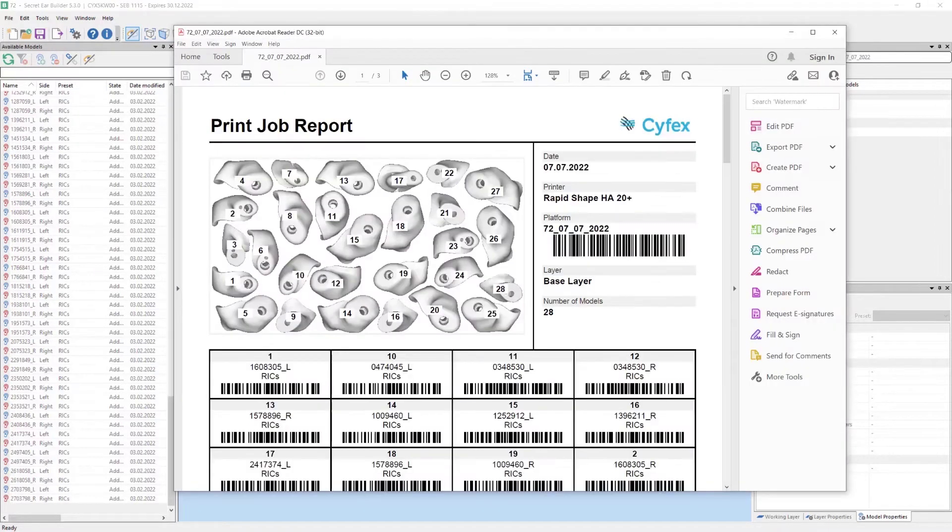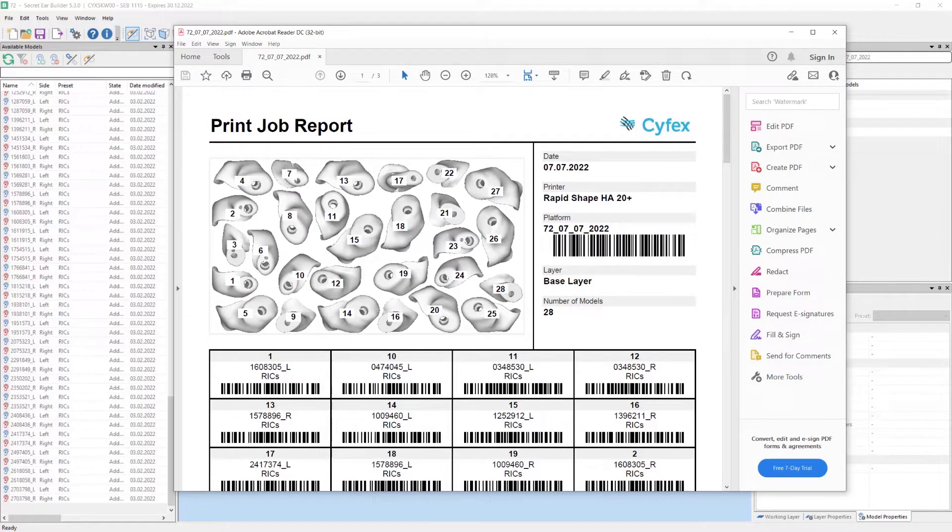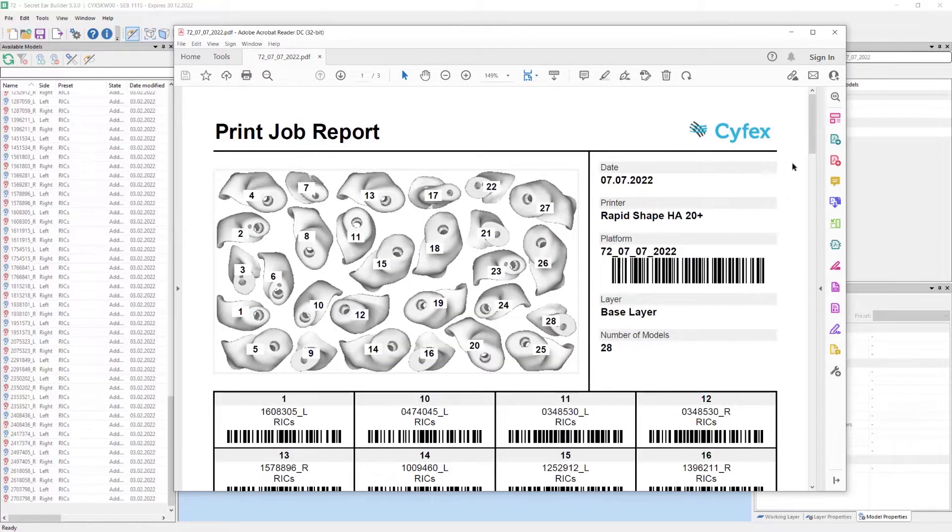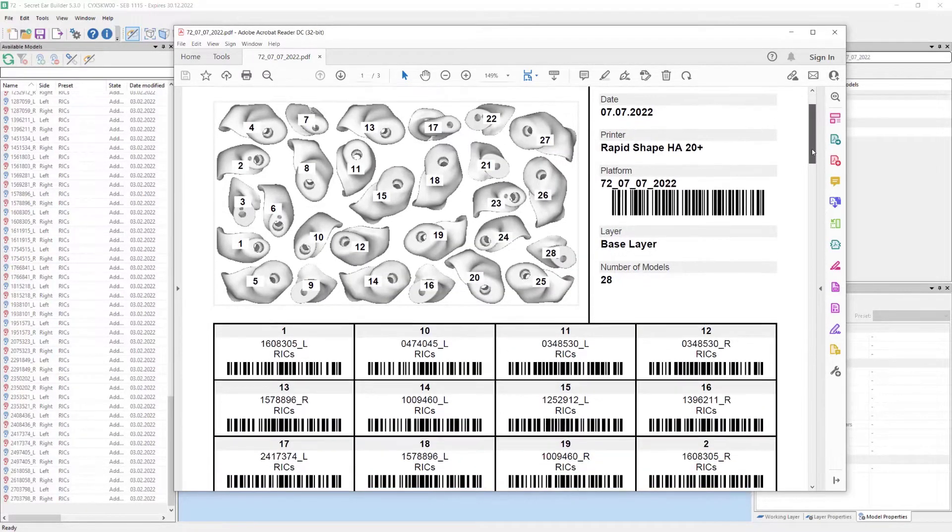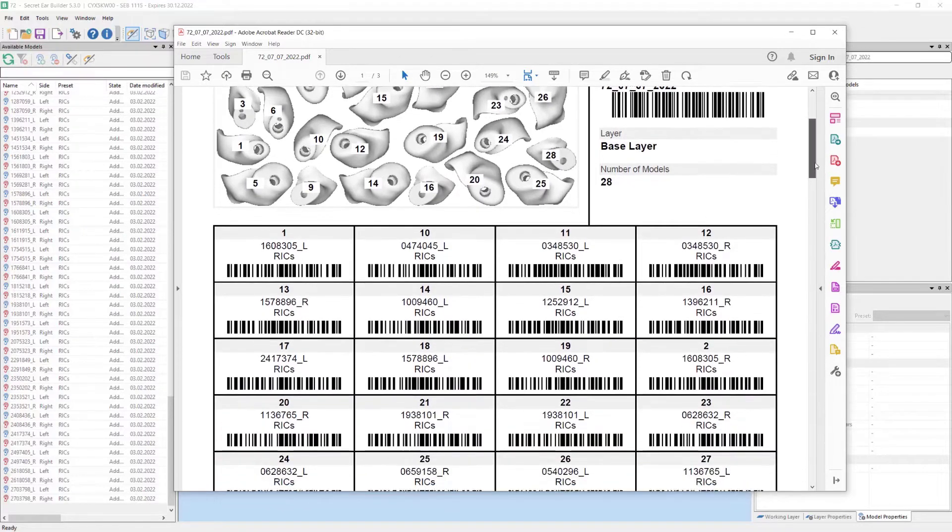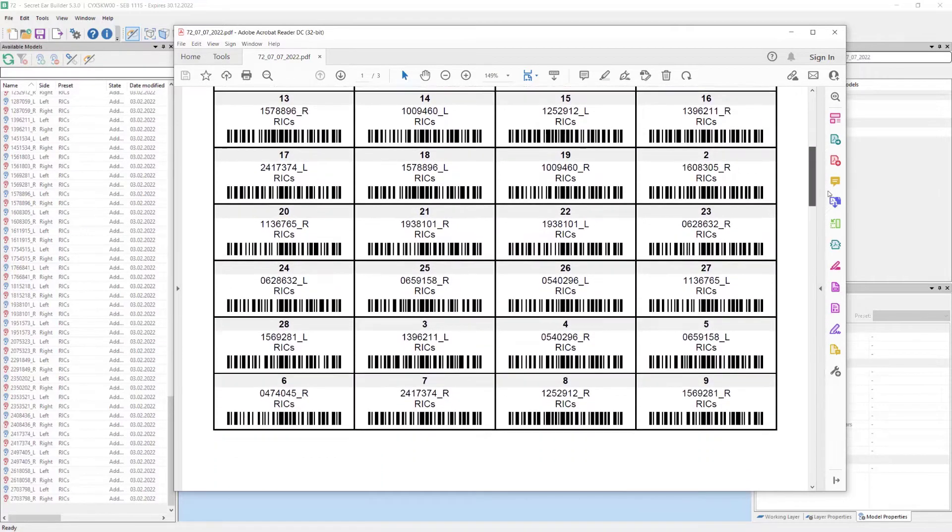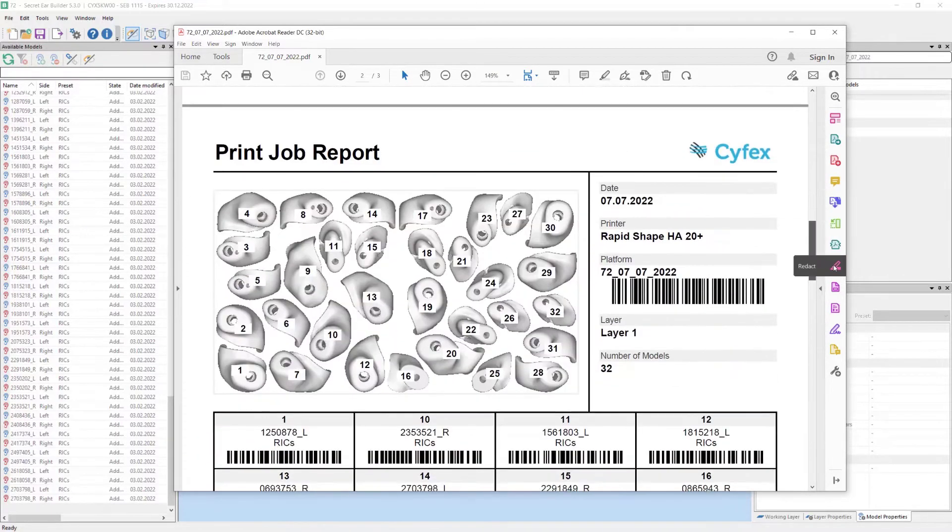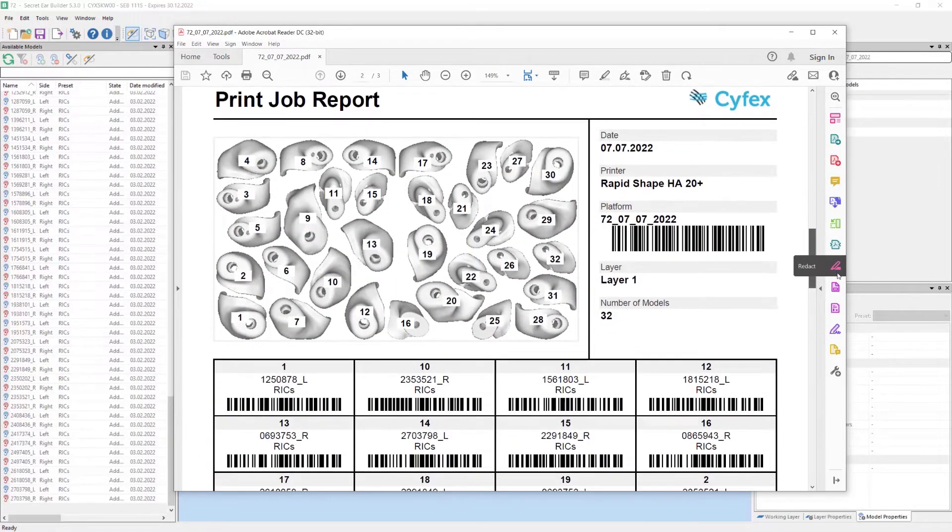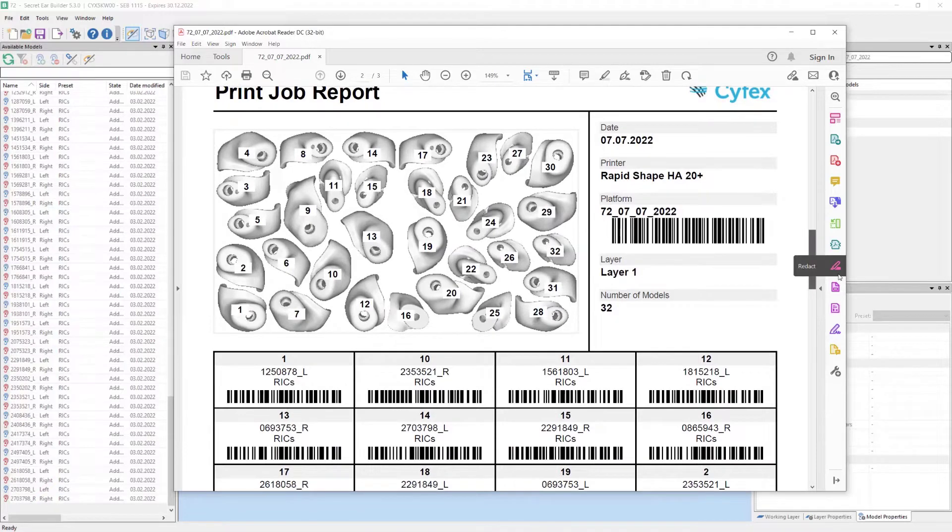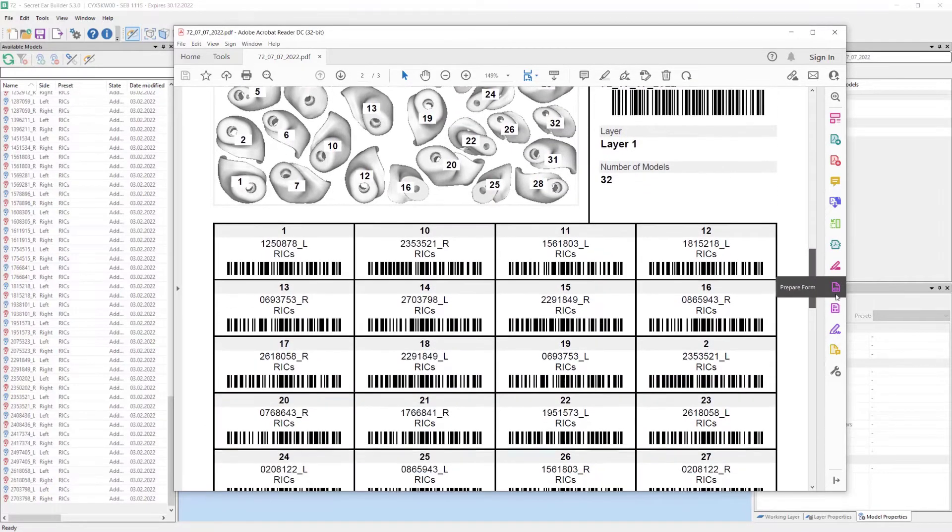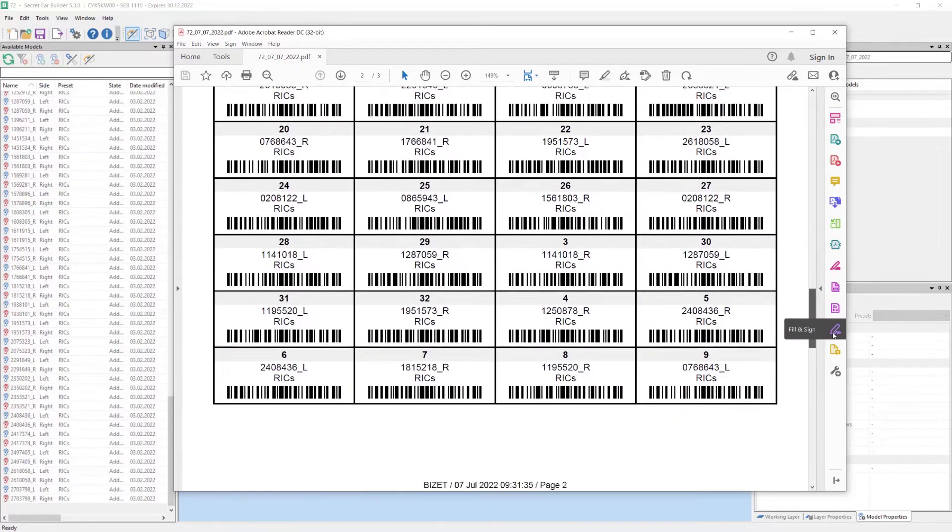The PDF print job report is shown. The ear molds are numbered and thus uniquely identifiable. In addition there is a barcode for each ear piece, which lends itself to automation in the workflow. The report may also play a significant role in order traceability and thus quality management.